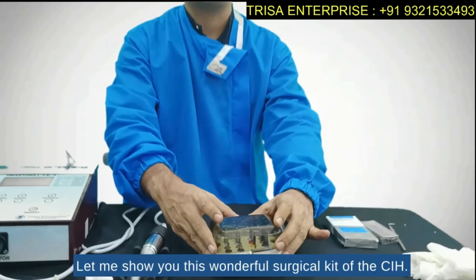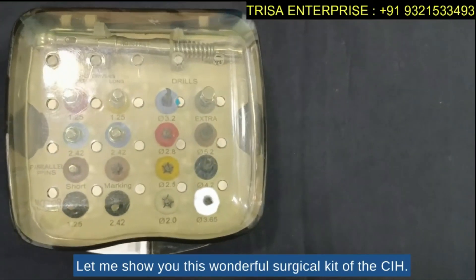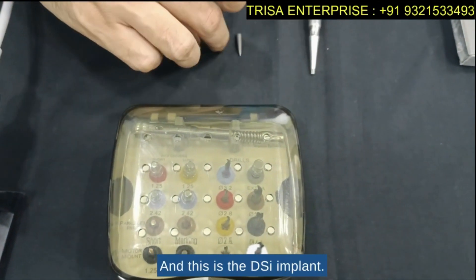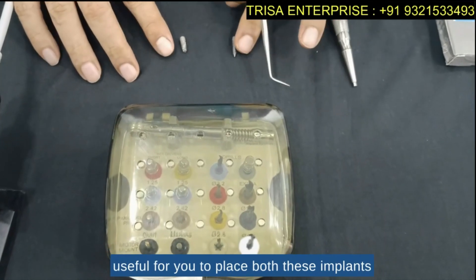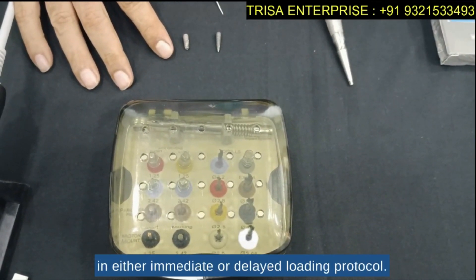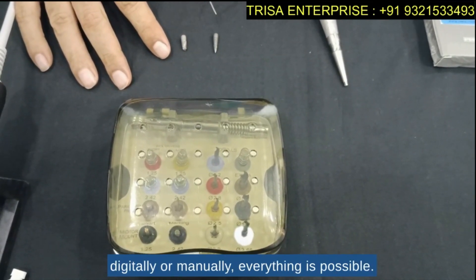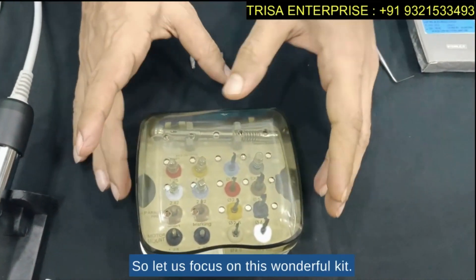Come closer — let me show you this wonderful surgical kit of the CIH. This is the CIH implant and this is the DSI implant. This kit is useful for placing both implants in either immediate or delayed loading protocol, and whether you wish to do prosthetics digitally or manually, everything is possible.